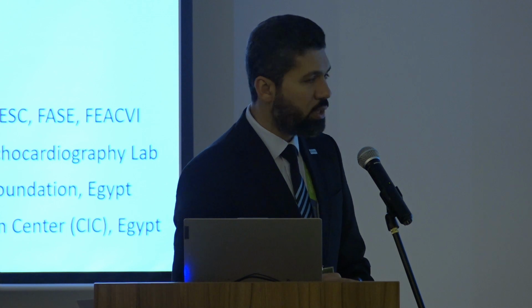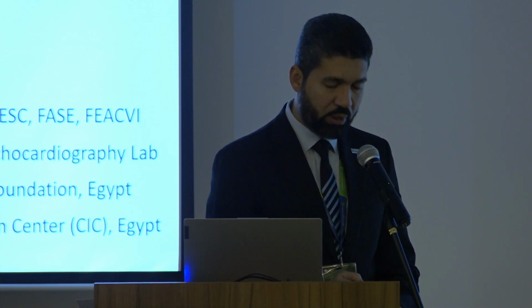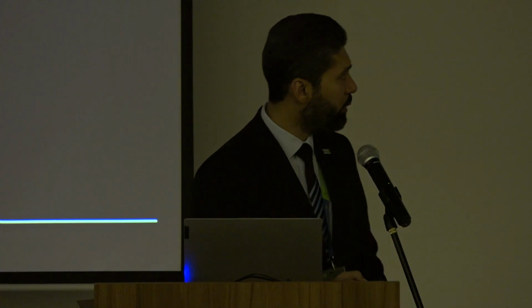Please. Assalamu alaikum wa rahmatullahi wa barakatuh. Thank you so much for the introduction. So as it has been said, I will be speaking about the mitral paravalvular leak. What can the 3D echocardiography add?